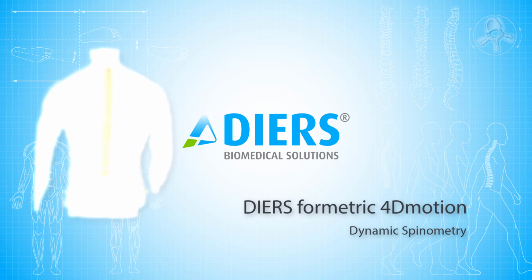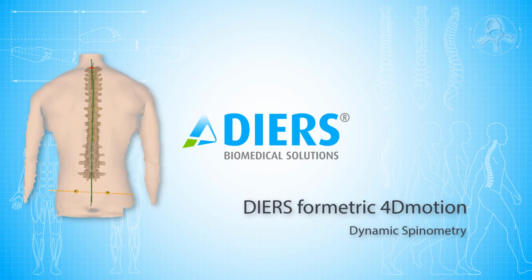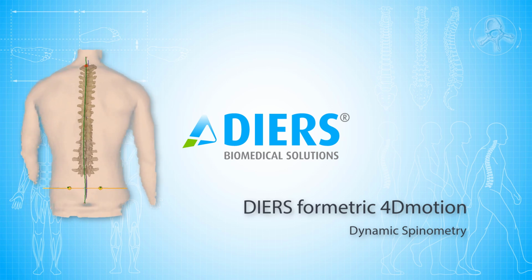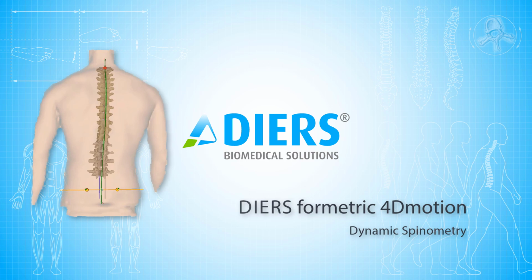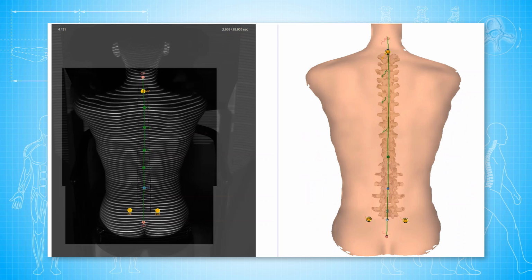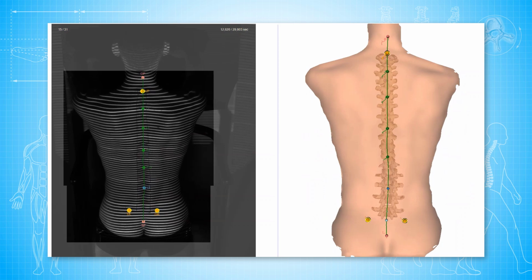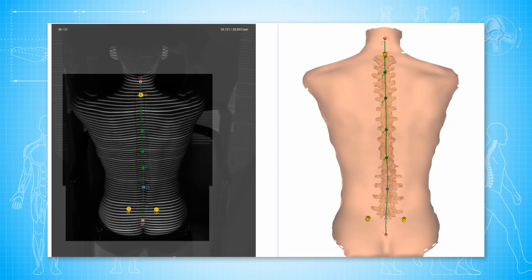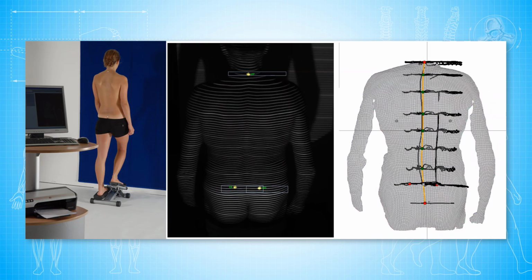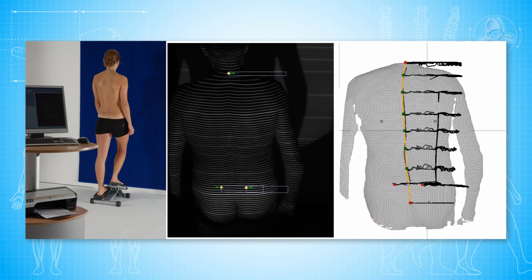The functional diagnostic approach, which is concerned with the observation of movement patterns in partially standardized test procedures, has already aroused early demand in the user group of video raster stereography for the visualization of a postural construct in motion. Initial attempts, such as the implementation of functional tests, like the posture test according to Matthias, have added considerable value to the optical spinal measurement and are still part of the product today. Further development by the examination types 4D Dynamic and 4D Dynamic Plus then paved the way for the calculation of a moving spine model.